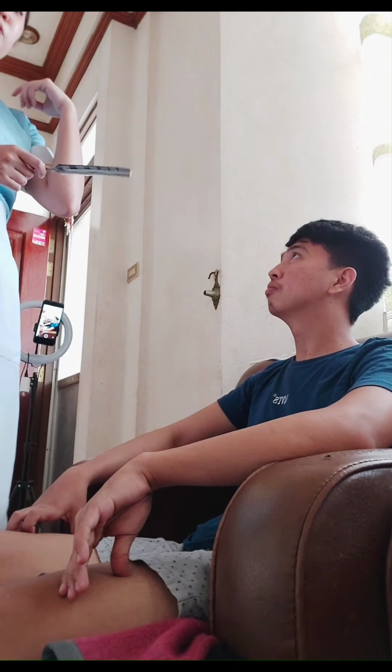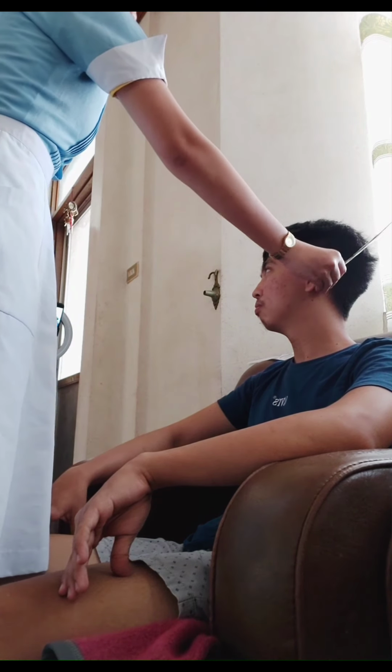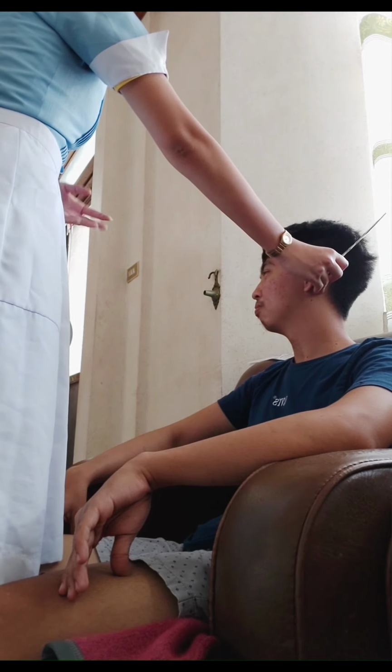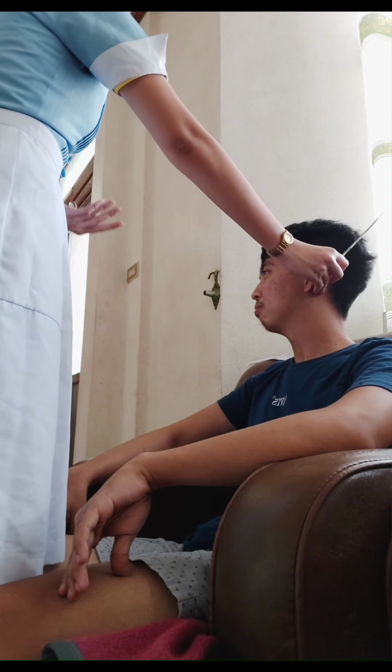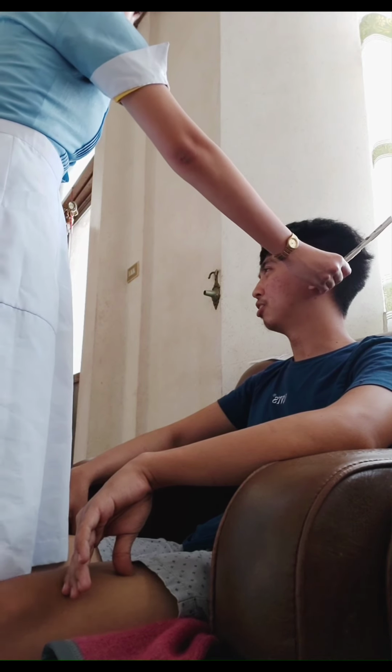Okay, and now to the right ear. I will first activate the tuning fork by striking it on my elbow. Then I'll place it on the patient's mastoid process. Okay, sir, can you tell me again if you can no longer hear that sound? Can you signal me? Is that okay with you? Yes, of course. Okay.